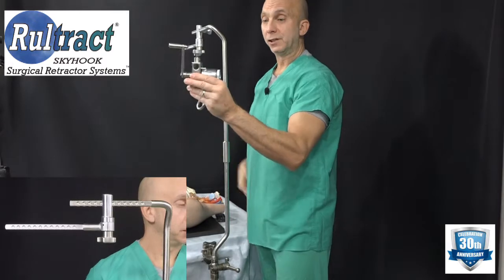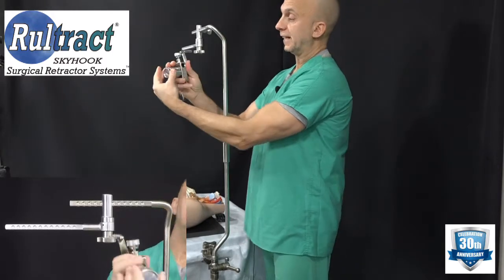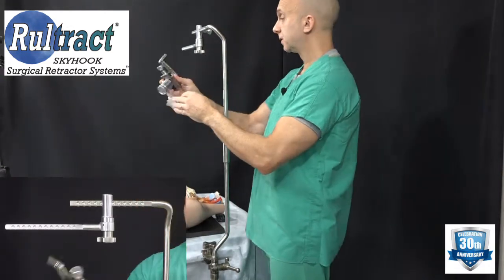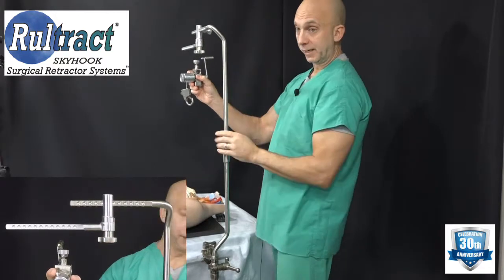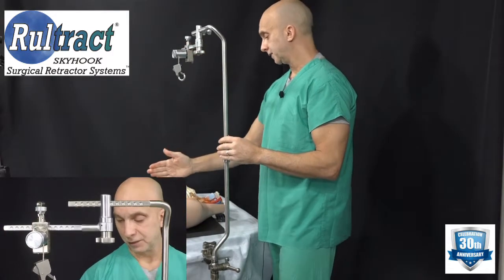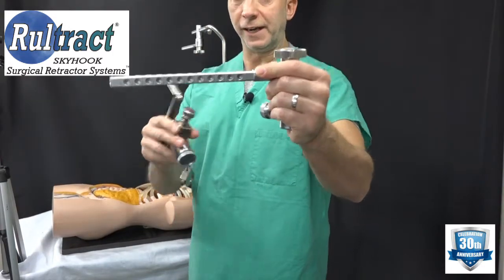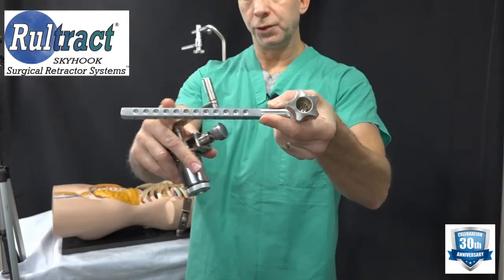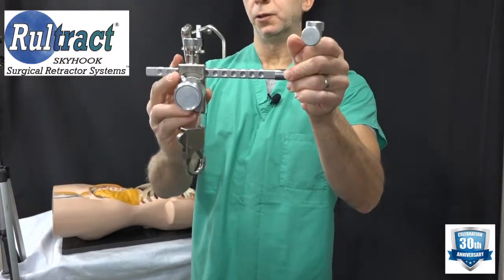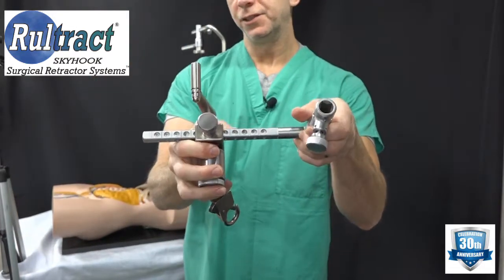Next, take your ratchet assembly. For the NUS procedure, I like to have the cable portion with the spool out over the patient's chest and the handle over the patient's head. Go ahead and slide that on — I'd like to see it positioned right over the center of the sternum. Just like the top post, the rotating extender bar has detents or holes cut into it.